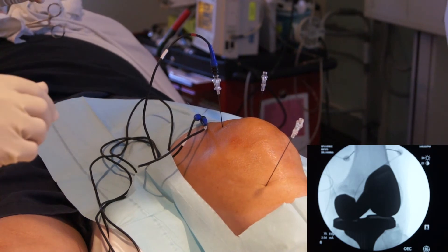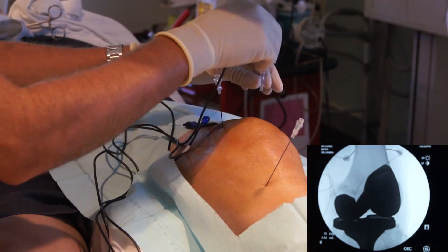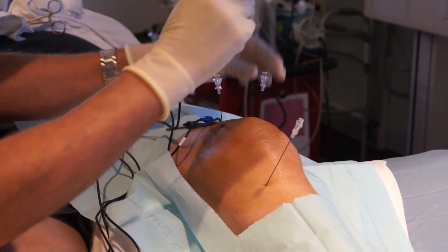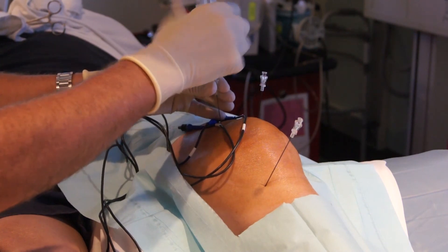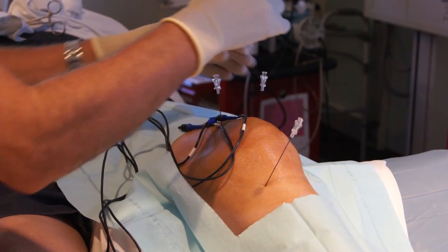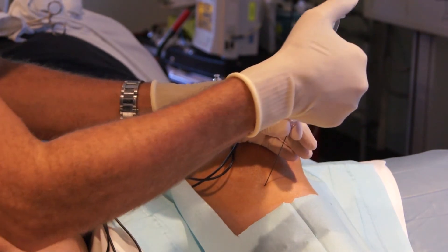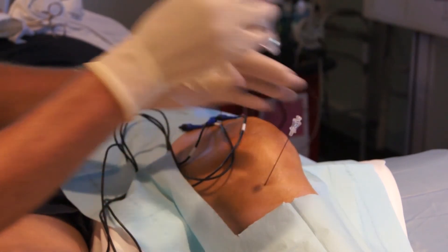We are doing stimulation and are not getting any motor stimulation, so we are going to numb the nerve shaft. After numbing the nerves, we will wait about 30 seconds to a minute until the nerve is numb, and then we will perform the radiofrequency lesion.